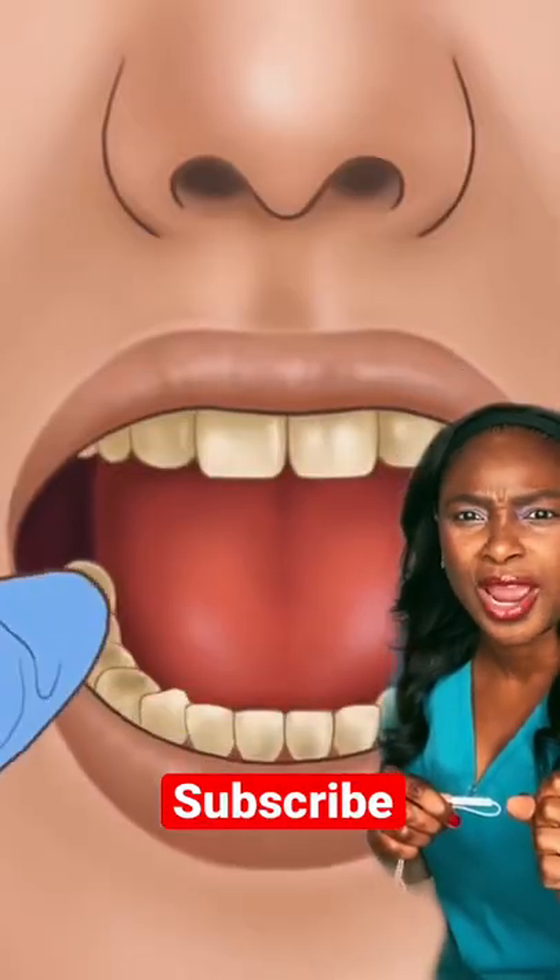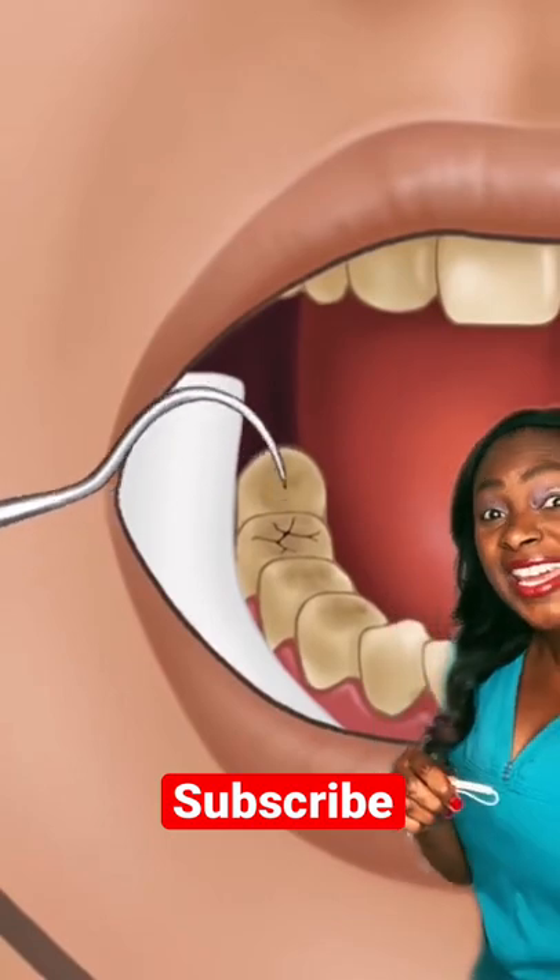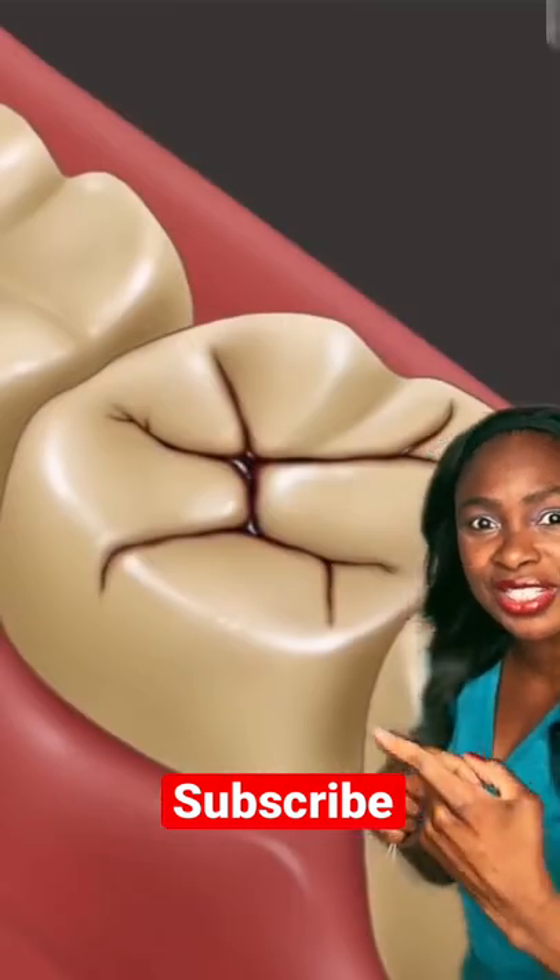A cavity being done at the dentist. Why are we starting with a wet cotton roll? I don't know. But anyway, here they're detecting the cavity and you can see it's black there.